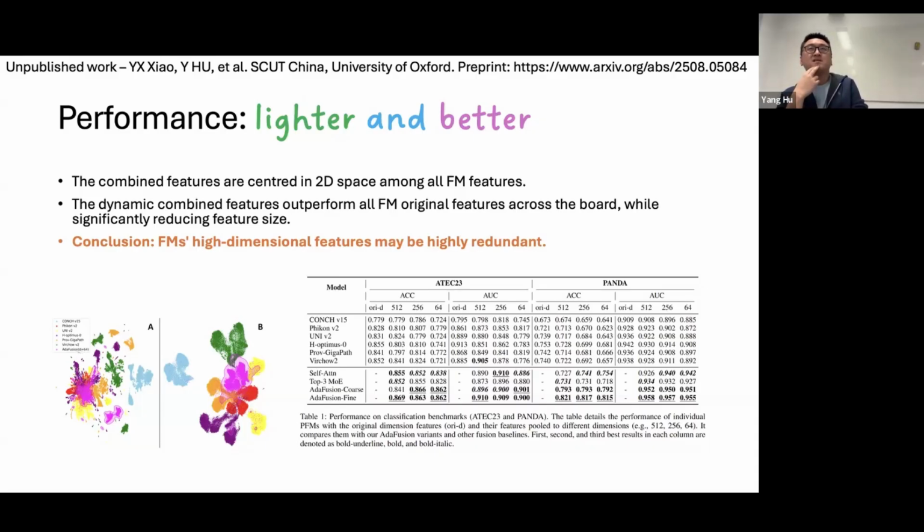I think it may be very interesting to explore some disease-specific foundation models, because a pan-cancer foundation model is technically reasonable, but clinically questionable. So the question is, is getting 10, 15, 20,000 slides per specific cancer enough to train a foundation model?